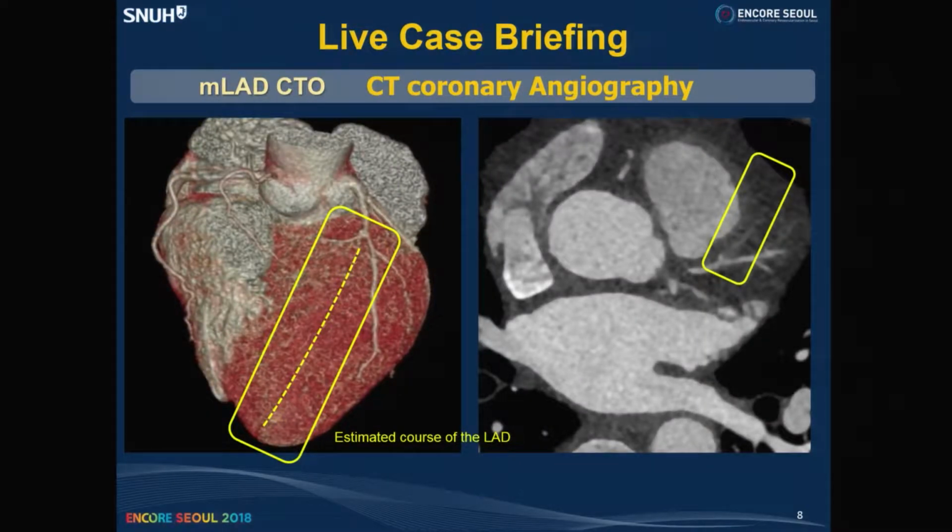CT shows a little bit difficult situation. At the proximal stump, there are numerous fine side branches that may mislead the soft antegrade wire into wrong directions. But a good sign is that on the right side, there is no calcification, and the CTO segment is not so long, actually very short. Thus, when we repeat the antegrade approach, it may easily pass to the distal lumen.